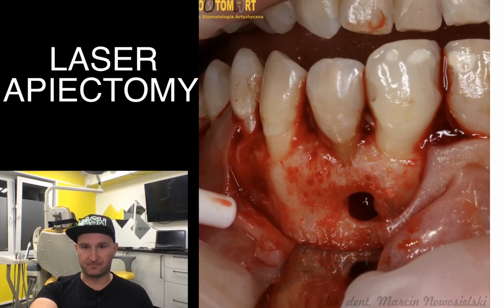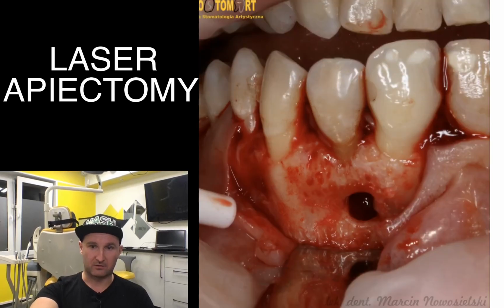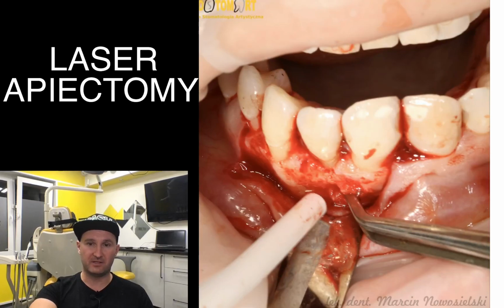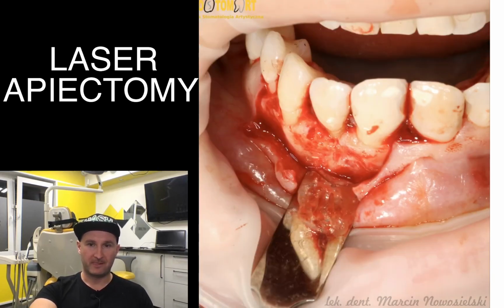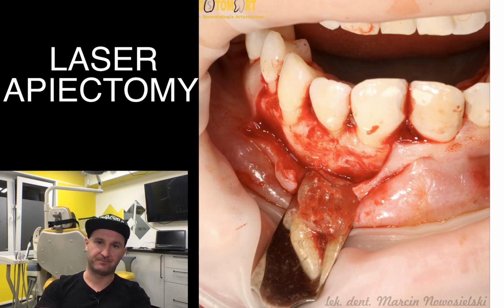After that, we just filled the cavity, as you can see the cavity on different projections, and after that we filled the cavity with PRF, so with this fibrin. I did not use any xenograft to fill the cavity. I did not use any membrane because I thought it is not necessary.